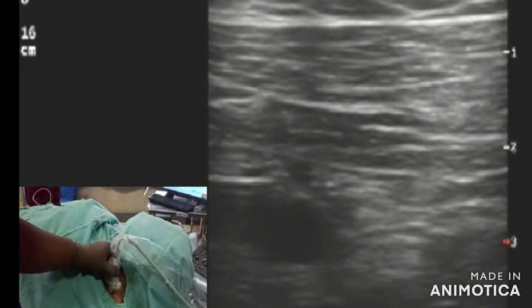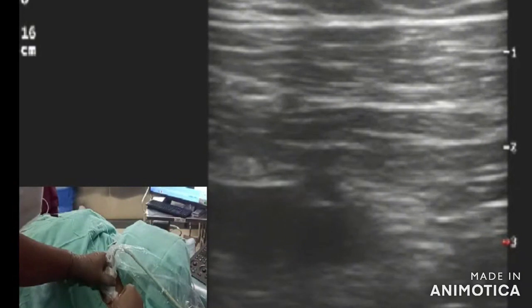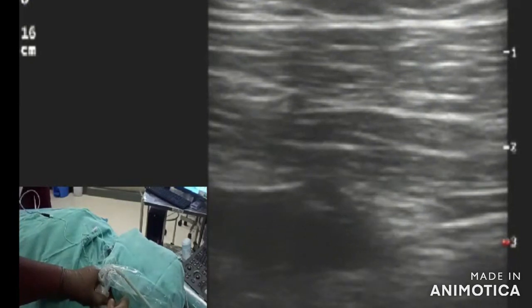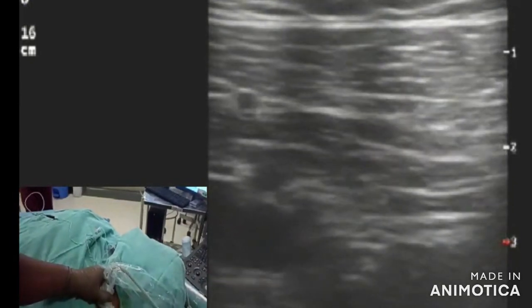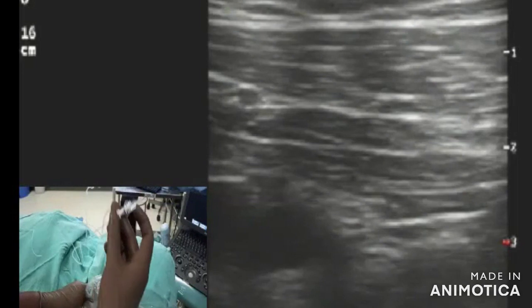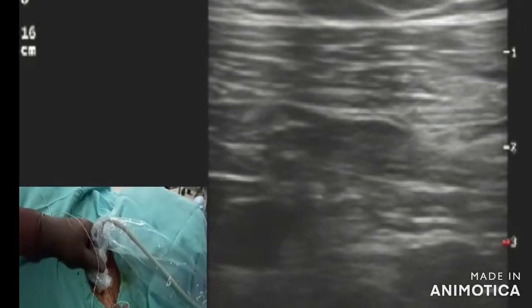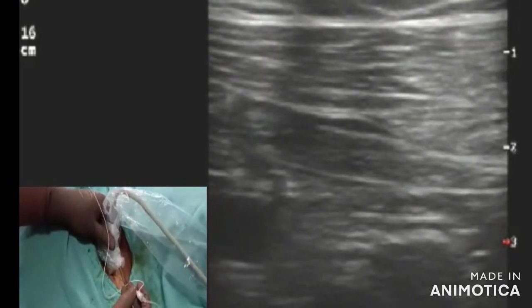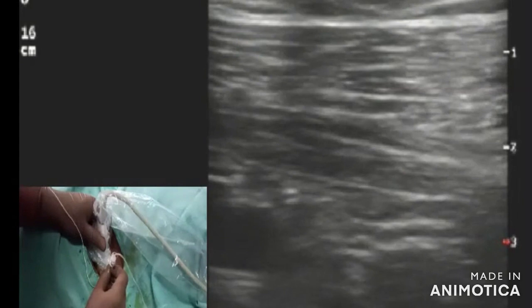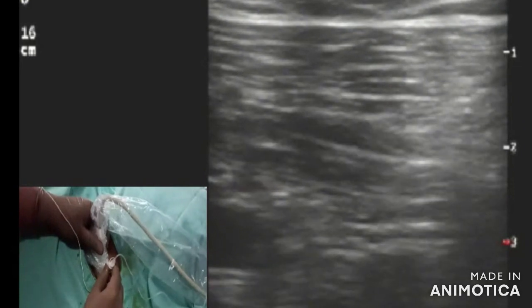As we scan the lateral infraclavicular region, it becomes the lateral infraclavicular block. In this video, the probe is kept in the costaclavicular space and local anesthesia is being injected. You can see the axillary vein and axillary artery, and the three cords. On the superior part you can see the lateral cord, below it the medial cord and the posterior cord.